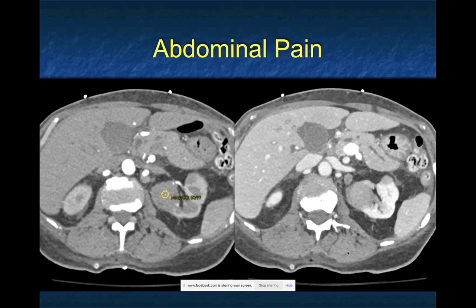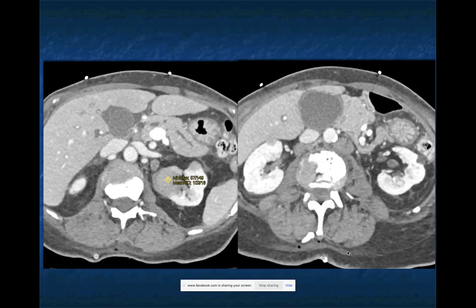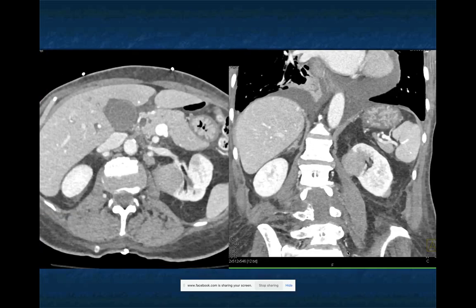Next case: a patient with abdominal pain. If you look carefully, I'm focusing on one mass in the left kidney, but there's also a second mass more inferiorly. You might say, well, maybe it's renal cell carcinoma - you can get two renal cells - or is it an abscess? The patient also has enlarged nodes in the left periaortic region and mild dilatation of the pancreatic duct. Looking at axial and coronal images, you really see multiple masses in the left kidney, including something in the perirenal zone.